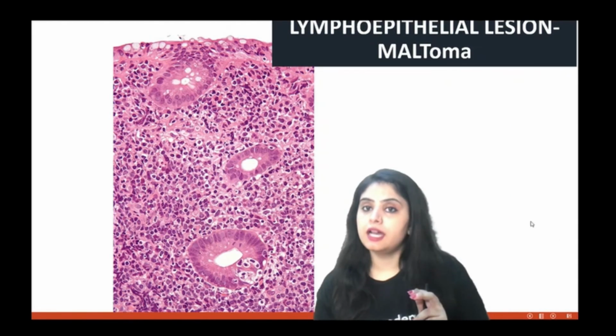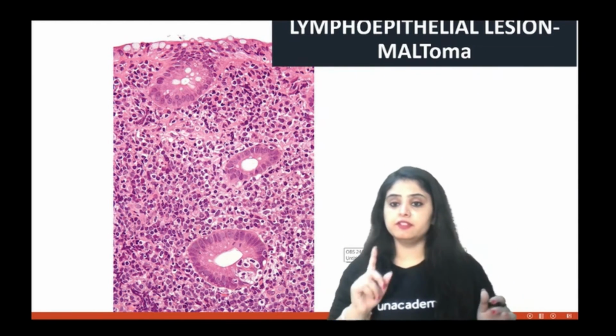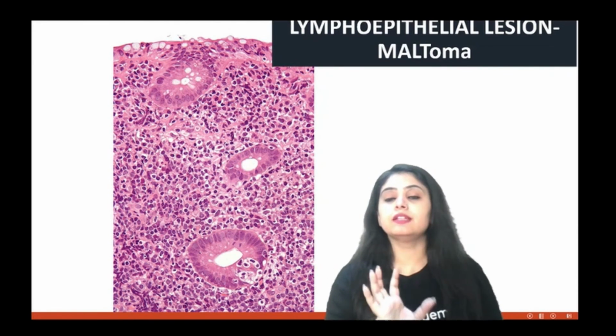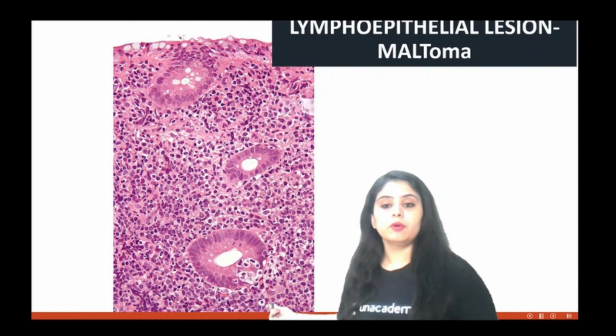See a better and a higher view picture of the same. So here what do you appreciate? Again, this is still not the highest power. I will zoom into it further, but train your eye to pick up something at this power because you never know, the examiner might give it to you like this. So look at this gland that you see at the bottom. And do you notice it is infiltrated by these lymphoid cells?